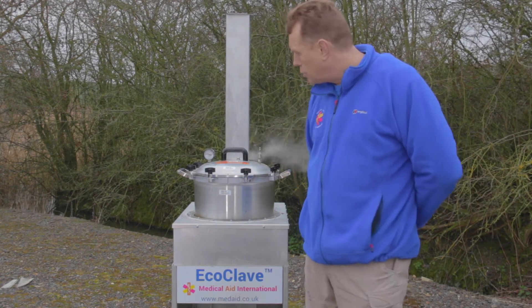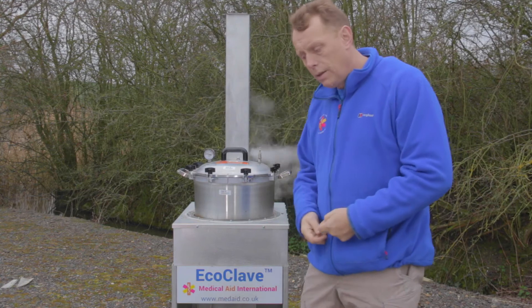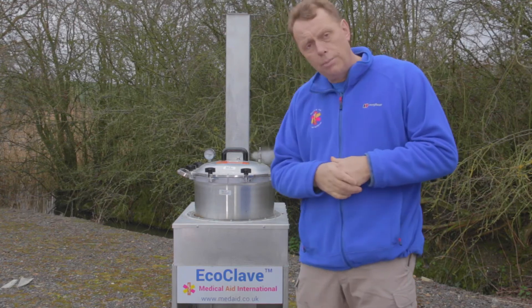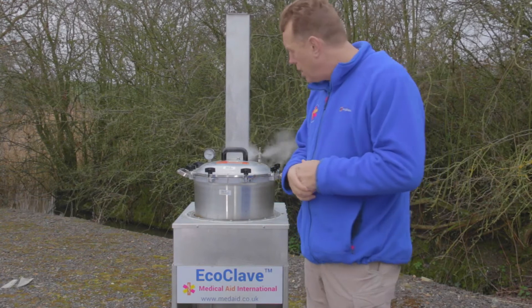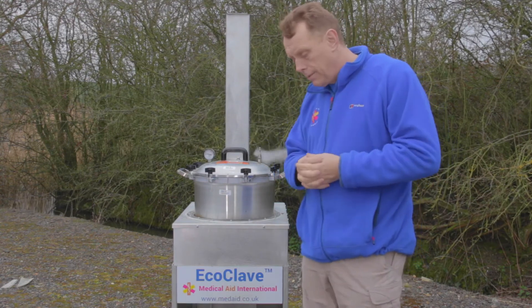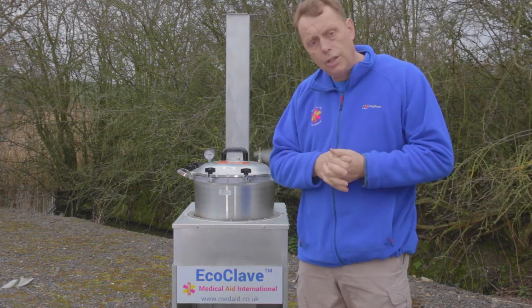One key thing when running an EcoClave is that it needs to be watched — it's not something you load with wood and walk away from. It needs attention the whole time. As you gain experience, you learn how to get the fire to the appropriate level and when to shut the flap to reduce the heat, because the heat keeps building for a while after you've shut the flap. There is a technique involved, and it must be remembered that you are dealing with high pressure steam, which is dangerous and does require attention.